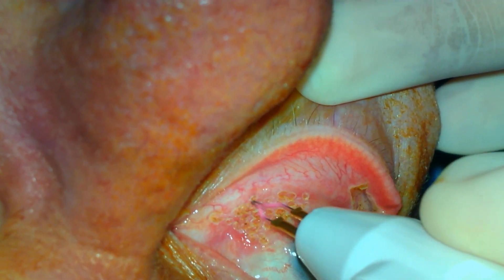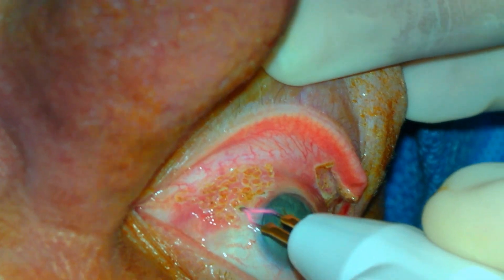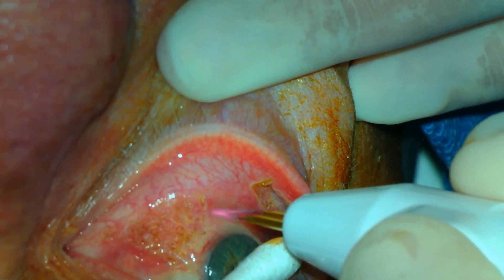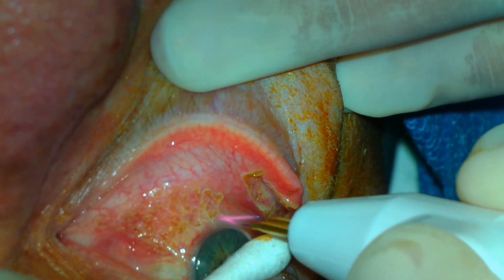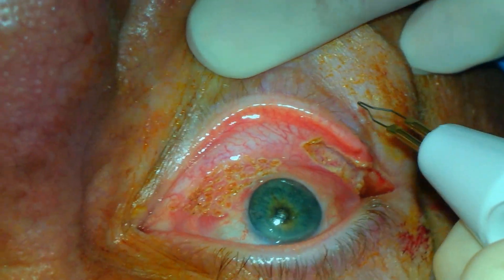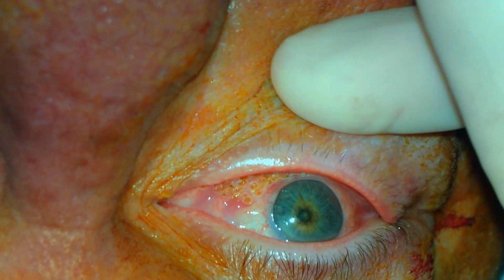It is important to only apply the cautery superficially to the conjunctiva. I've used a number of different approaches in addressing conjunctival chelasis. I've resected the redundant conjunctiva and sutured the defect closed. I've also lifted the redundant conjunctiva with forceps and cauterized the redundant conjunctiva in the forceps. The more focal treatment with those techniques seems to give me a focal area of scar, which was sometimes bothersome to the patient.